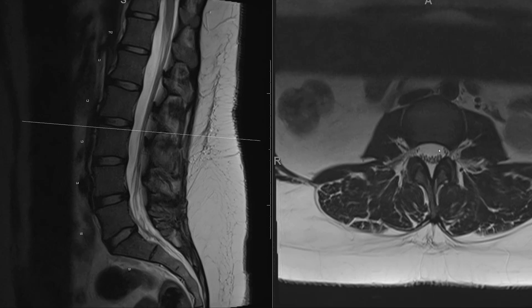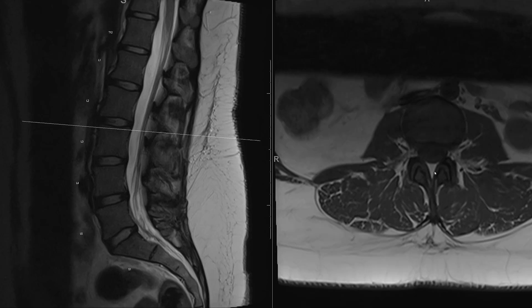Looking at the thecal sac itself — we talked about the cauda equina already. CSF is bright on T2-weighted images, so you can see CSF filling the thecal sac. Fat is also bright, found in the back and in the epidural space. The dura and arachnoid run around the thecal sac, and anything outside of that but still within the spinal canal is the epidural space, which contains fat.